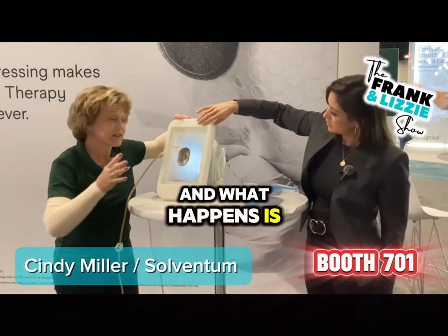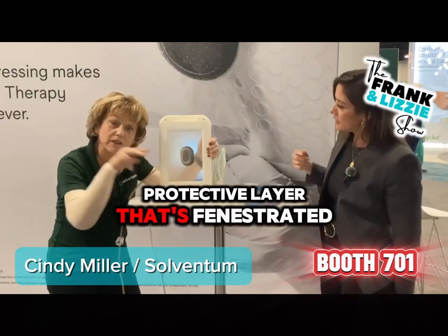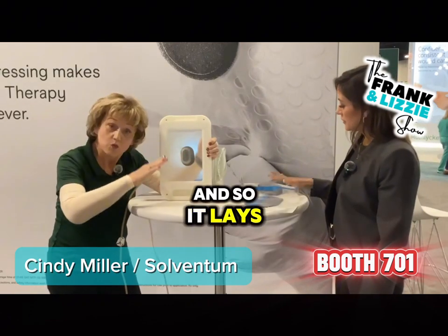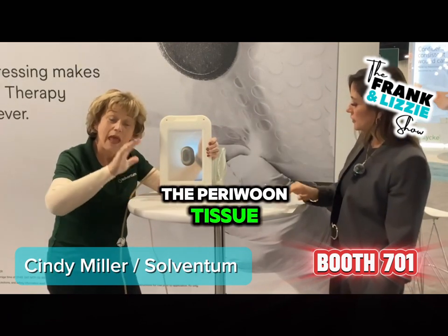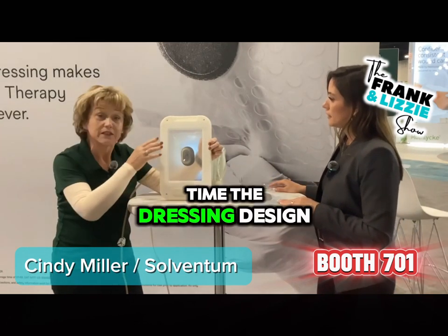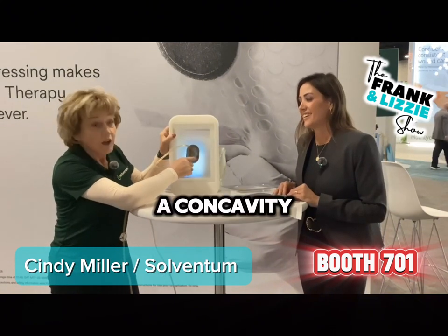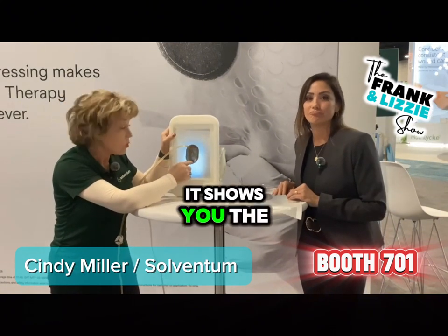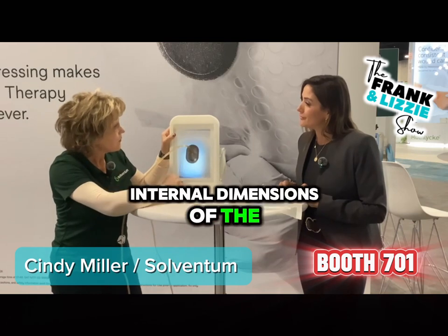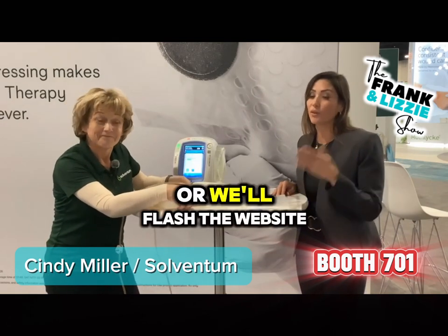And what happens is that this integrated dressing has a protective layer that's fenestrated. And so it lays right on top of the peri-wound tissue and it pulls the wound up and in. And at the same time, the dressing design allows that to go down in. So what we see is a concavity that shows you the internal dimensions of the wound. Oh, cool.